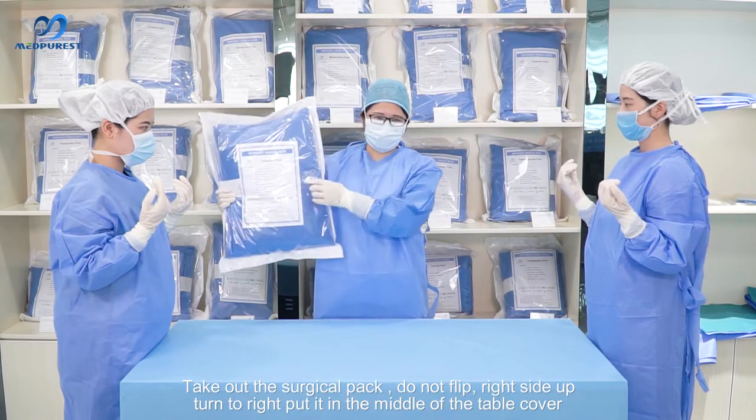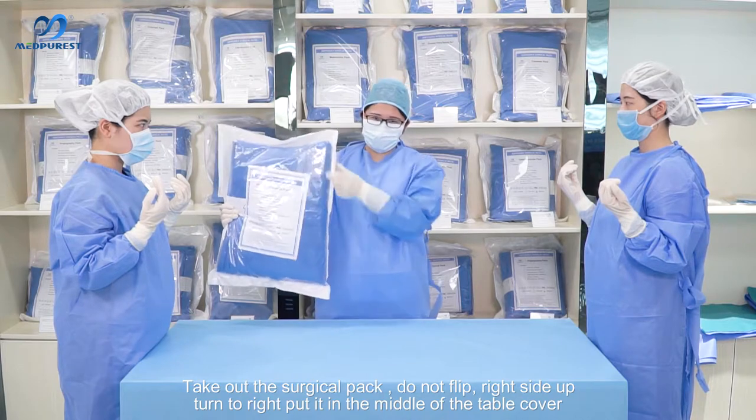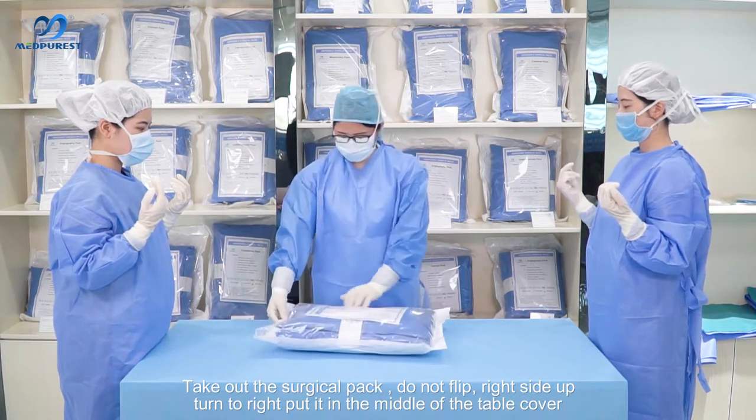Take out the surgical pack. Don't flip it — keep it right side up, and turn it to the right in the middle of the table cover.